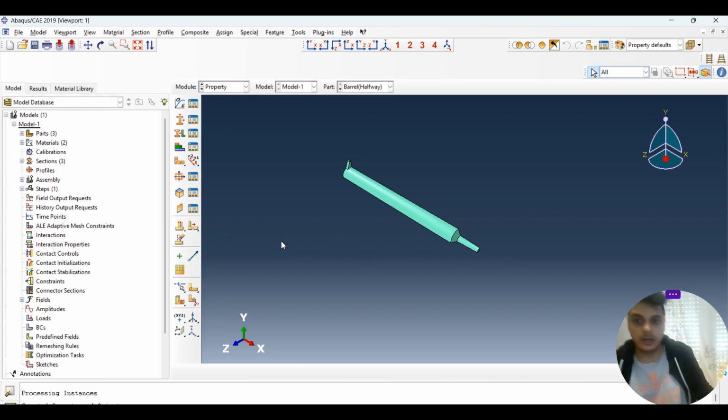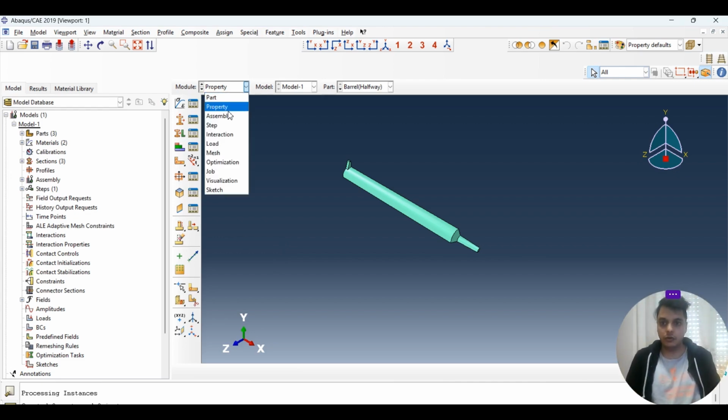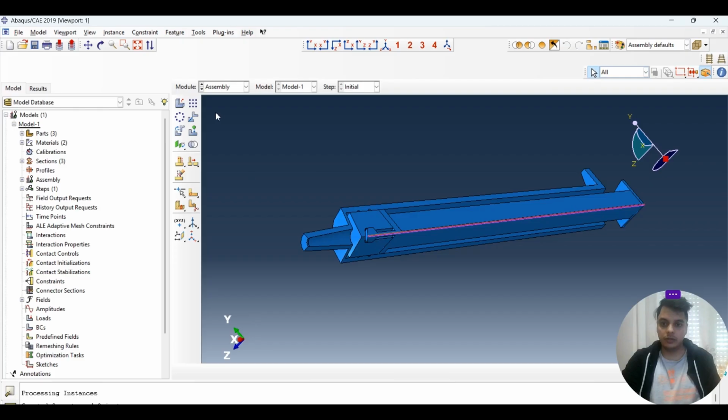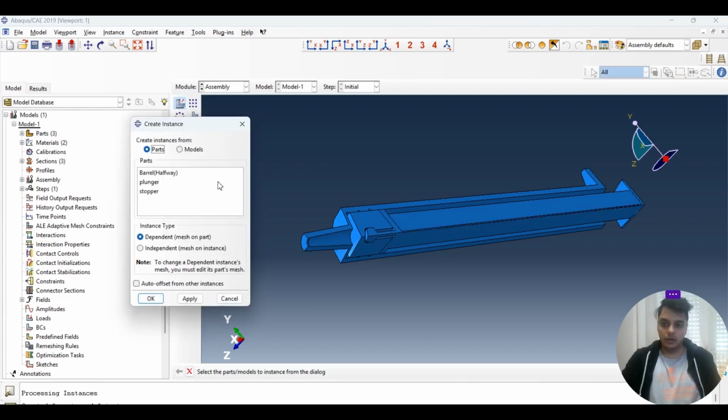Okay, perfect. So we have defined the section, and now, as per our module, we have to define the assembly, which is already done. If you want to put on some other things, just use this create instance option. Here you can bring the dependent and independent mesh.